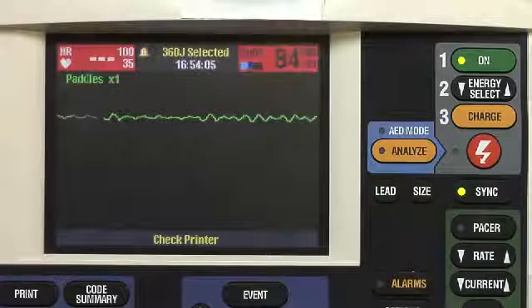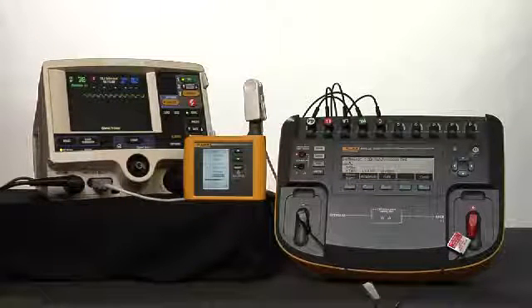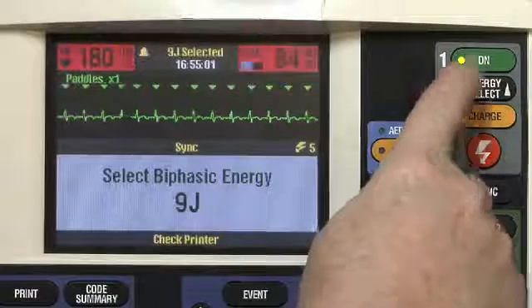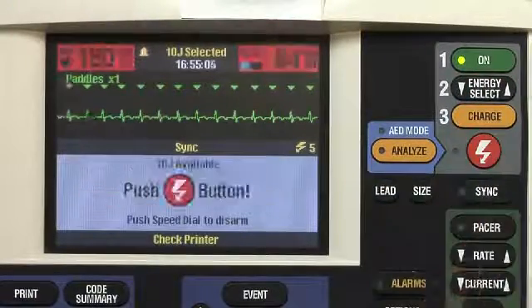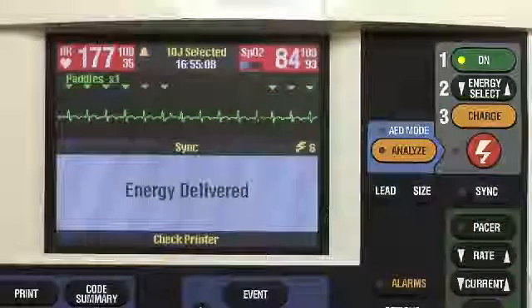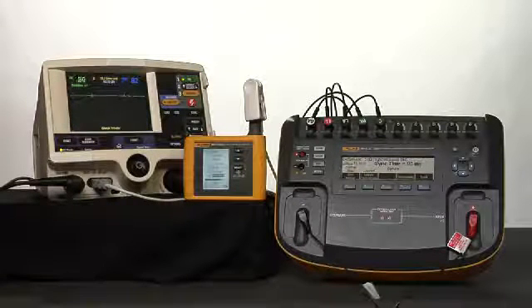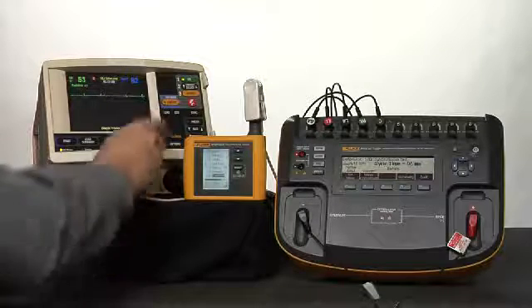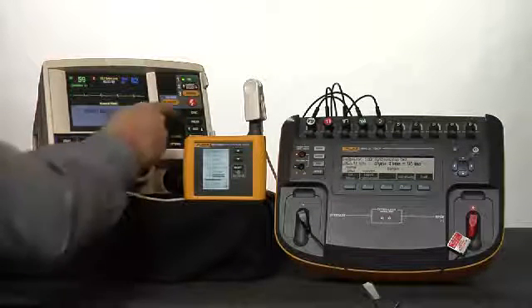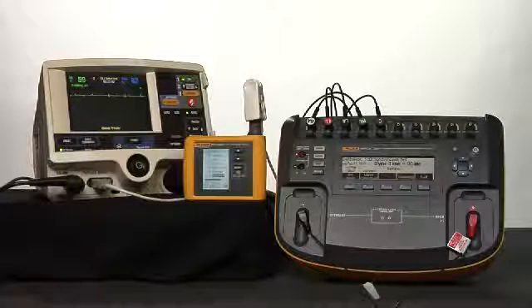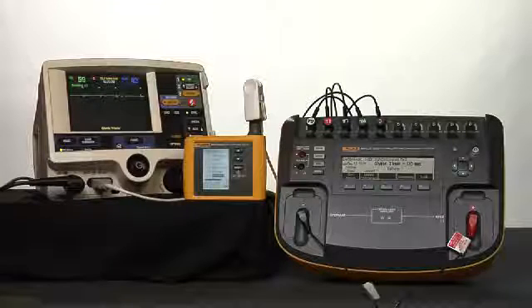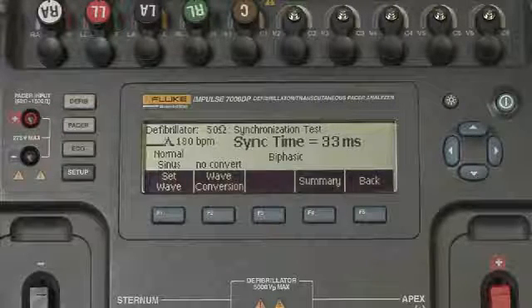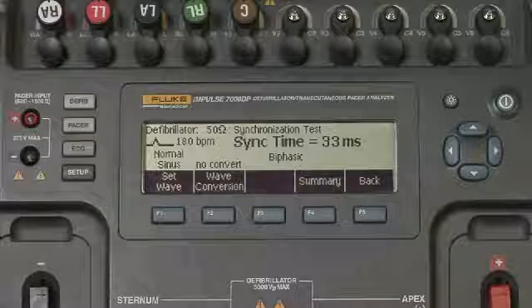Press the Sync button on and select local. Sync button is on, LED is flashing. Charge the device under test to 10 joules. 10 joules selected. Charging. Discharging. 96 milliseconds measured, which is above the recommended 60 milliseconds, so we should run this test one more time to confirm. Verifying 10 joules selected. Synchronizer is turned on. Sync markers are marking the R waves. Charging. Discharging. 33 milliseconds measured, well within the range of 60 milliseconds or less.